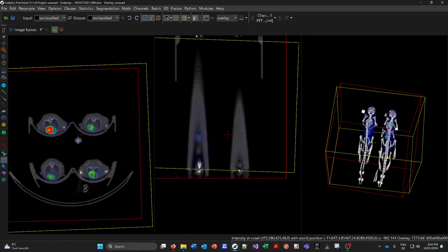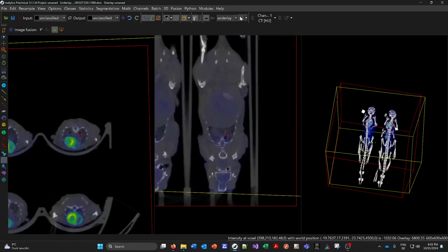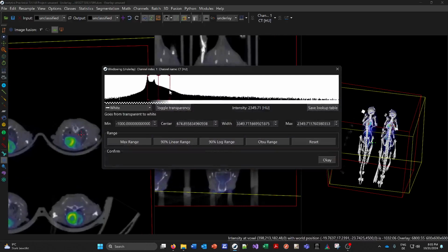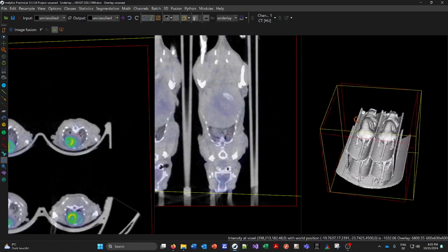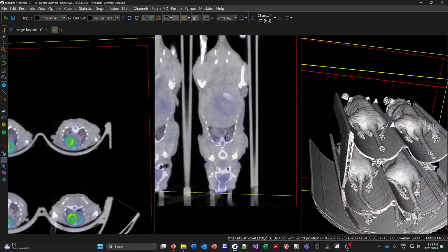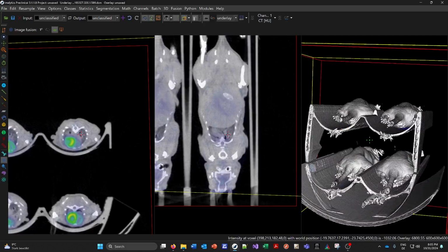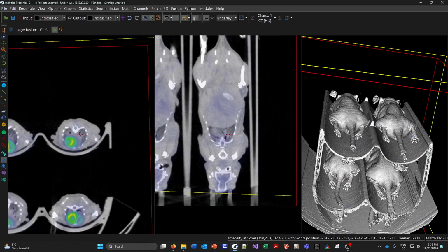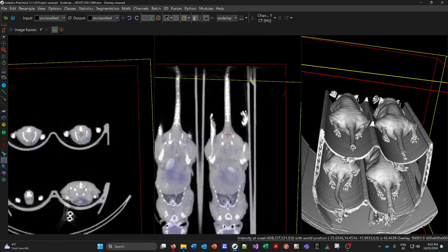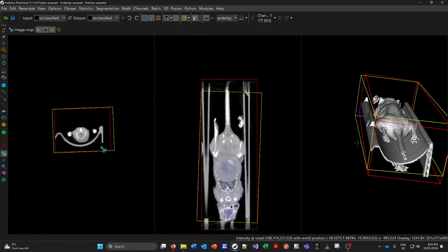And then as a next step, you might want to crop out the mice. And here this mousepad actually has an interesting phenomenon. It has ribbons on the side here, see here, this is one ribbon here, 2 ribbons, 3 ribbons, and 4 ribbons, and that indicates the mouse position or the ID. So this is mouse 1, so we can go here, and now we can use the cropping tool to crop out this mouse here.